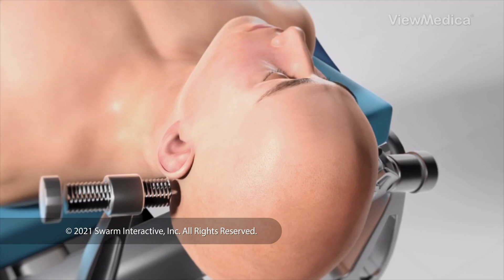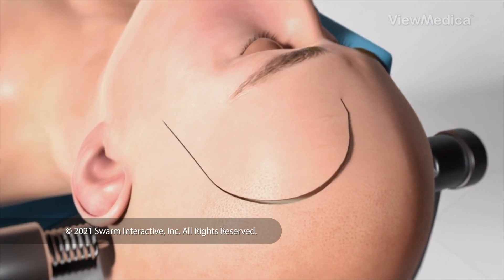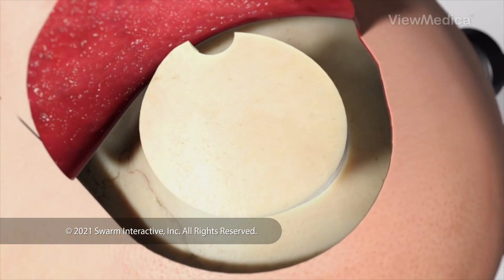To begin, you're put to sleep and your head is secured. We make an incision in your scalp. Then, a part of your skull is removed so we can reach your brain.